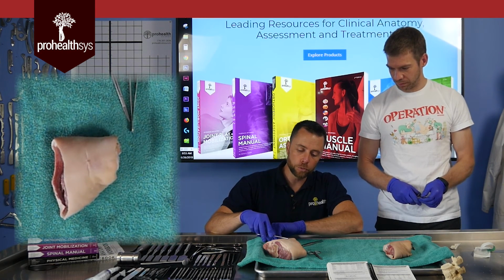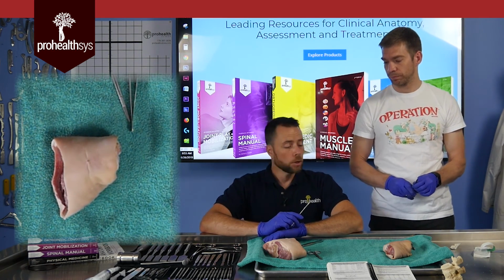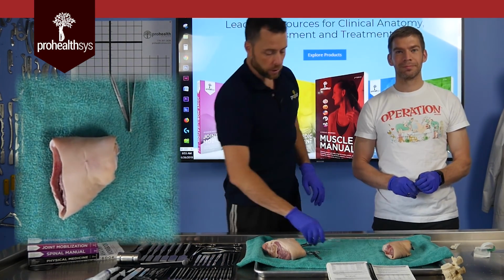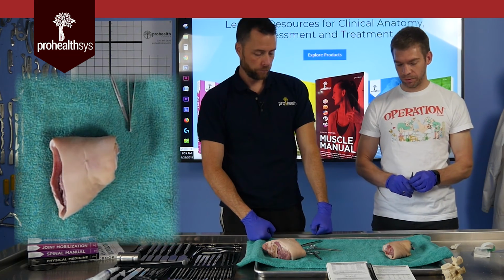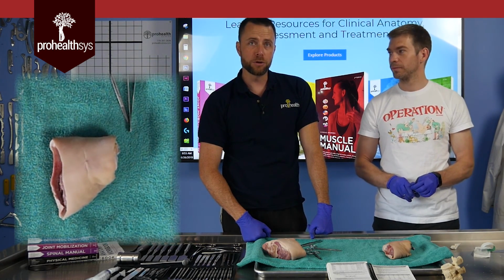I'll usually do 2 or 3 loop overs, and you can come in again and pull on the tissue and see that usually they hold fairly well. So it depends. 3 is good enough. Okay, hopefully you found this useful, and we thank you very much for your time. Is there anything else you want to add? I think we did it. I think the patient will be okay. I think the patient is going to make it to the dinner table this evening.